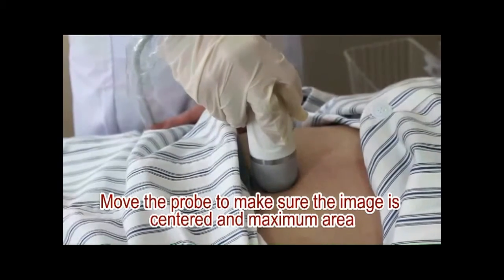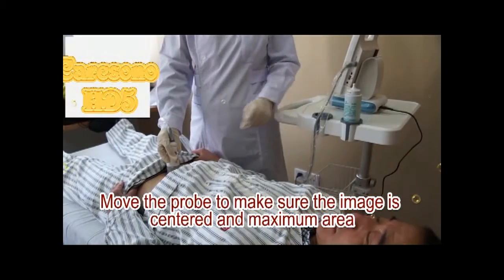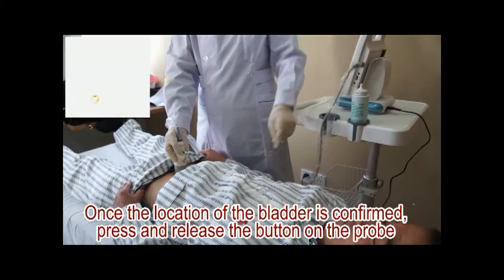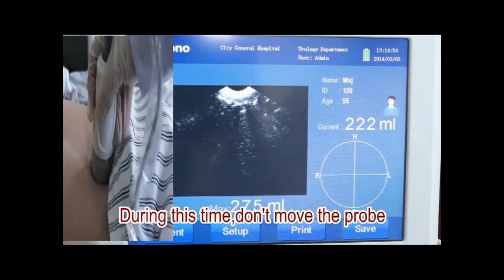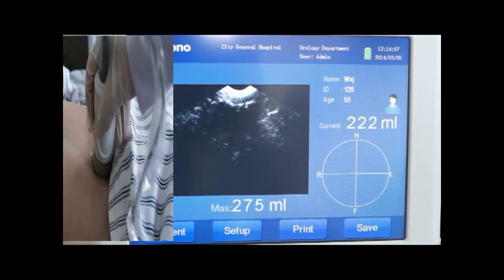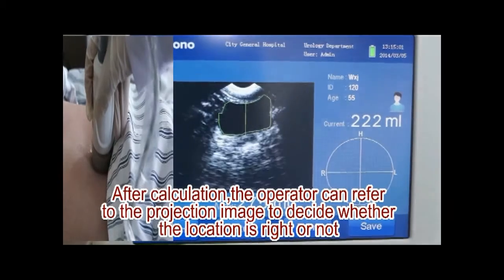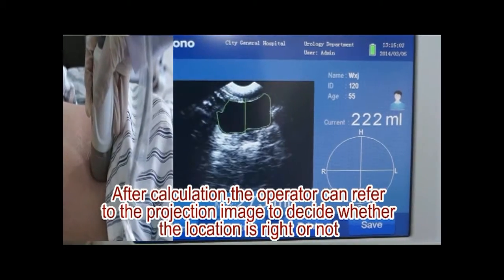Move the probe to make sure the image is centered and within the maximum area. Once the location of the bladder is confirmed, press and release the button on the probe. During this time, don't move the probe. After calculation, the operator can refer to the projection image to decide whether the location is right or not.